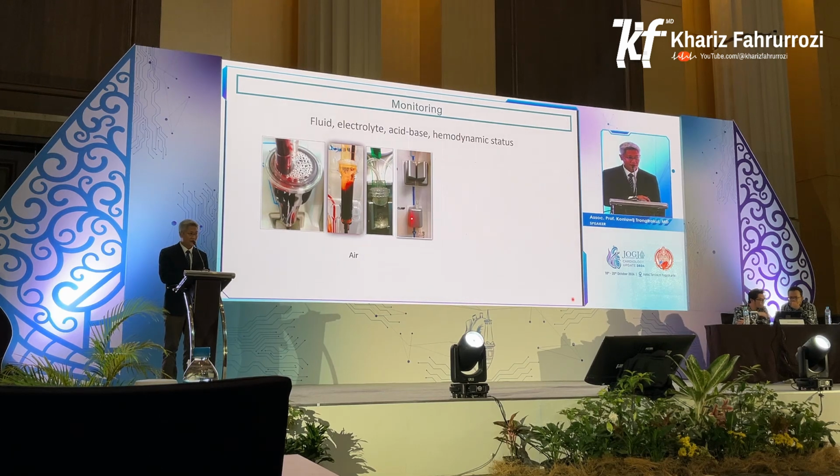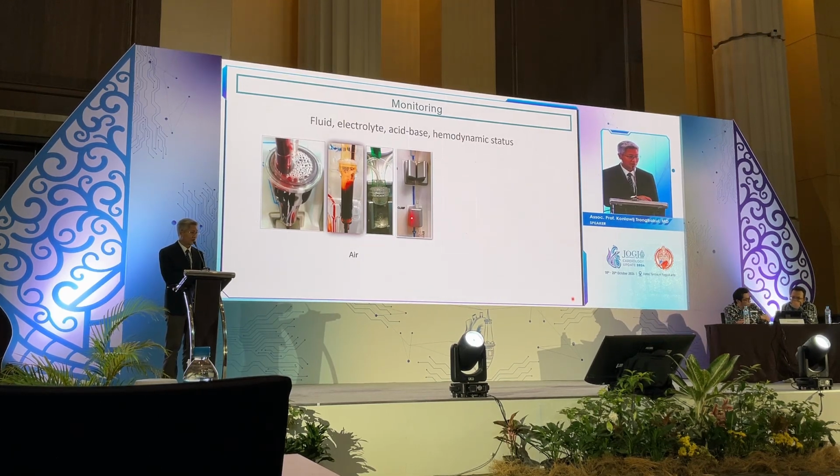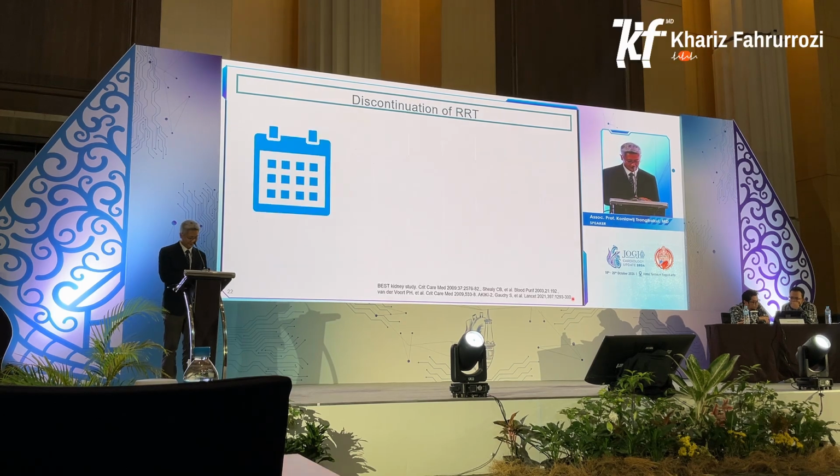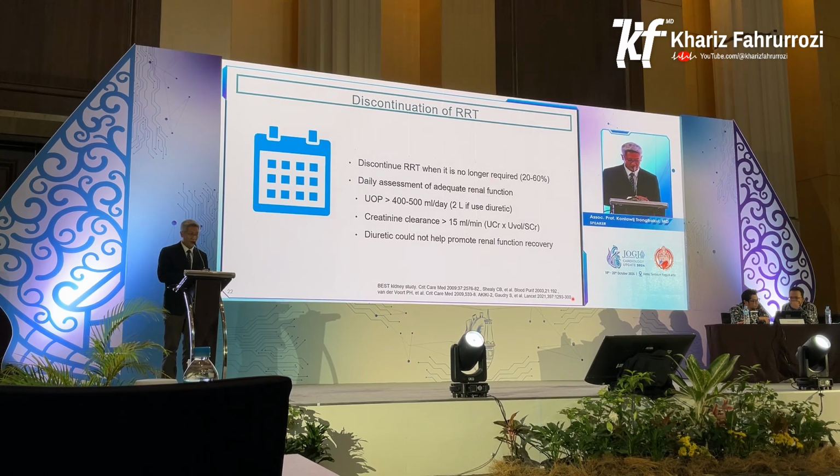For CRRT, a special issue that we need to focus on is care of the membrane and clotting. Therefore, we have to give the patient anticoagulation as well. And in terms of discontinuation, when it's an appropriate time, if renal function recovers, it means there is no need to perform CRRT anymore. Usually, we should look for urine output if it exceeds 500 ml per day, or in the case with diuretic, the cutoff should be about 2 liters.